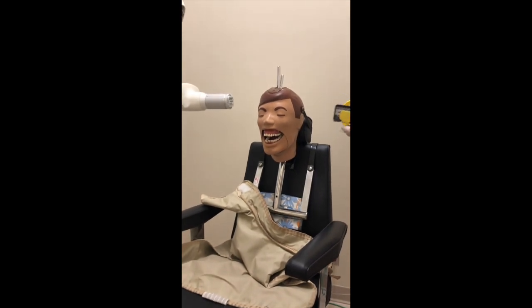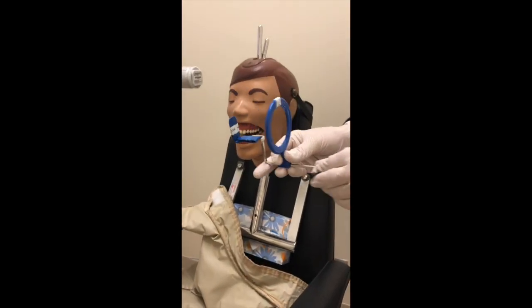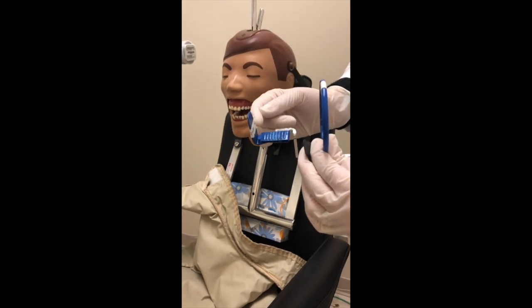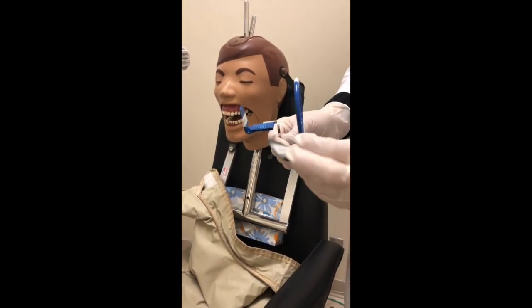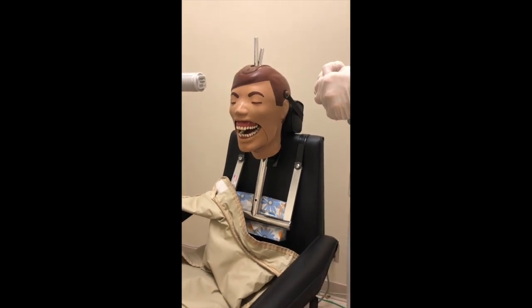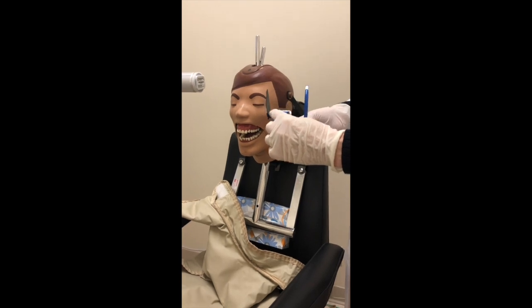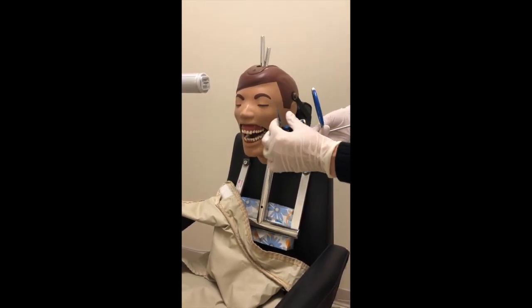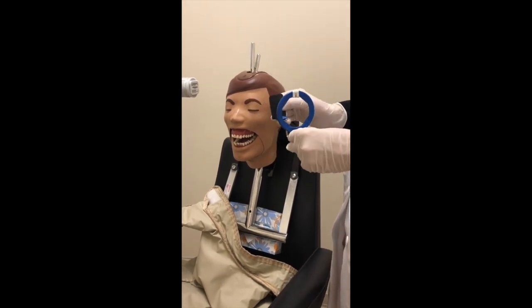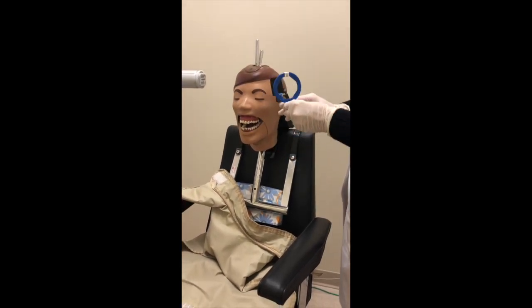Now I will go over the anterior PA placement. As you can see the ring looks a little bit different. We do still have an aiming ring and an arm, but the bite block looks a little bit different. This is meant for a size 1 film. Again, the A in the tray. And if the x-ray or the PSP doesn't want to sit firmly in the slot, sometimes you can use a bite tab and it will add a little bit of extra so that the x-ray will stay snugly in place. This is an anterior ring — it is meant for x-rays from the canine to the canine, on the top and on the bottom.